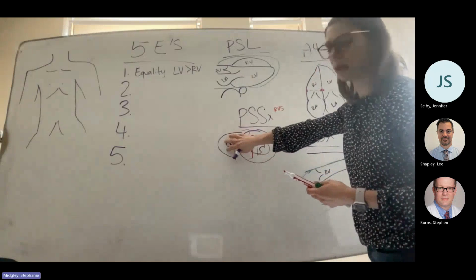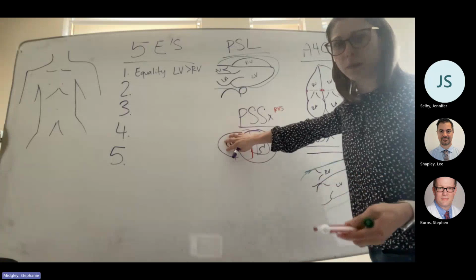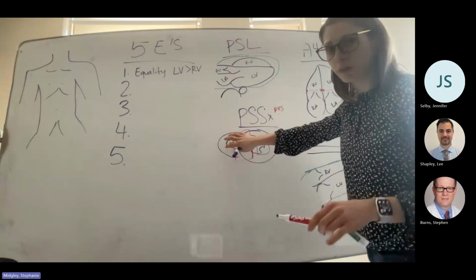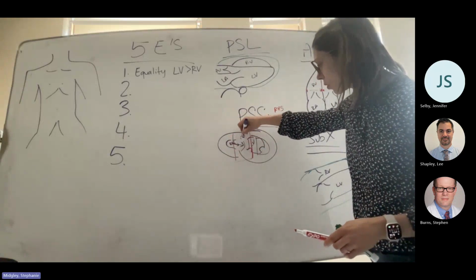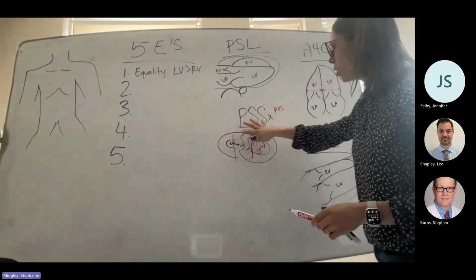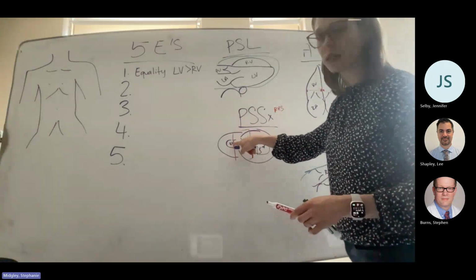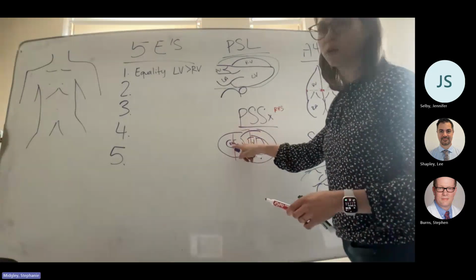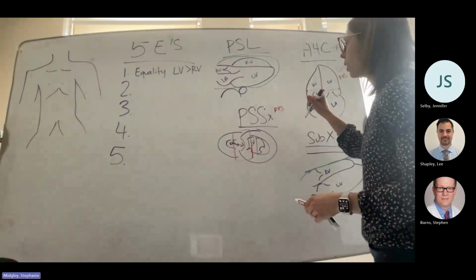So when I have right heart strain, whether it's acute from like PE or an MI or chronic from like pulmonary hypertension, and the right ventricle gets overloaded, whether it's volume or pressure, it's going to at some point exceed the pressure of the left ventricle, and it's going to cause that septum to then shift. And so you might not be able to compare exactly right to left ventricle size, but you can get an idea if the right ventricle is really large in this view. And I can tell you if the right ventricle is overloaded compared to the left. We'll go through right heart strain in a minute.